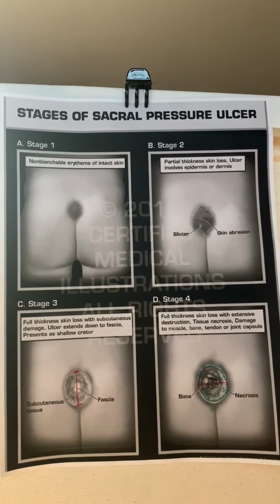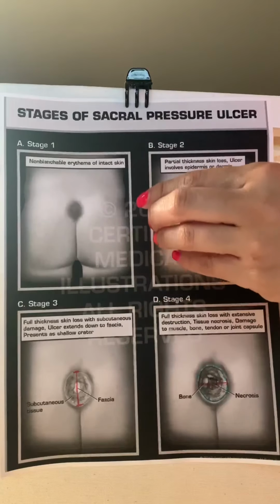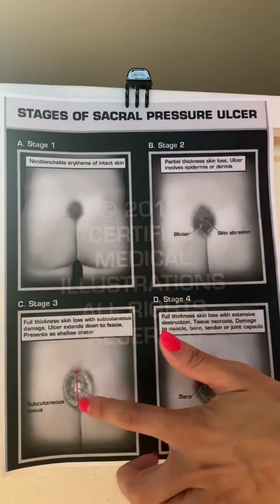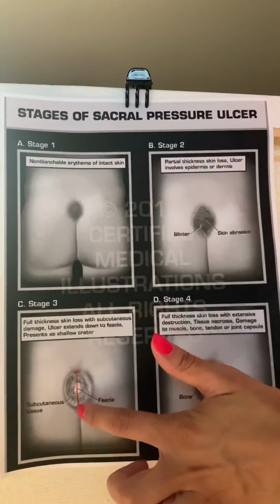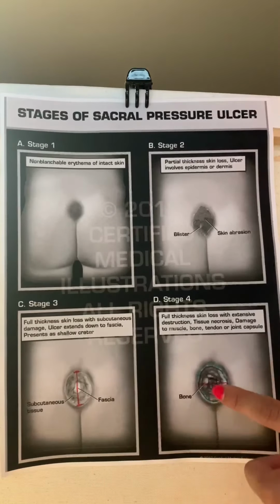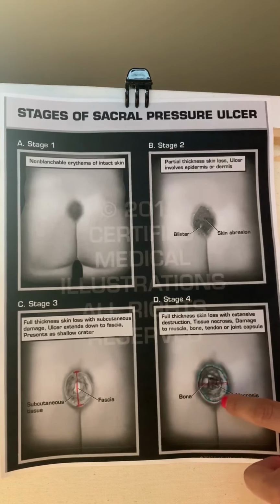So what this digital wound measurement application does is, they take a picture of a wound like this, or the wound up here, and it'll actually detect the edges of the wound. Here, it'll go up and down and measure from the top of the wound to the bottom, and over here, from side to side. And then it will also detect dotted lines across the whole wound to get the circumference of the wound.